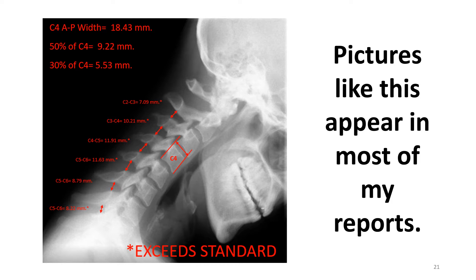I enter all the information on a clean flexion lateral for the sake of illustration to appear later in the report. The C4 AP width and the 50% and 30% values appear on the graphic for easy reference. All of the interspinous measurements are listed adjacent to their level, with an asterisk if they exceed the 30% standard at C2-C3, or the 50% standard from C3 to C7.